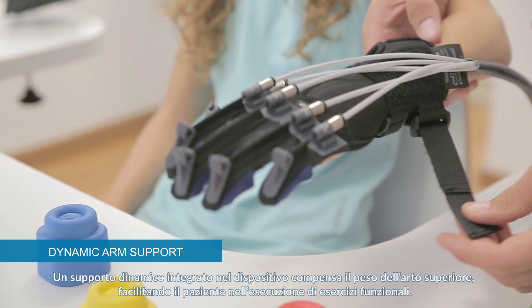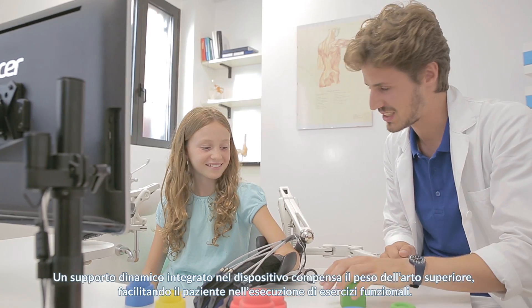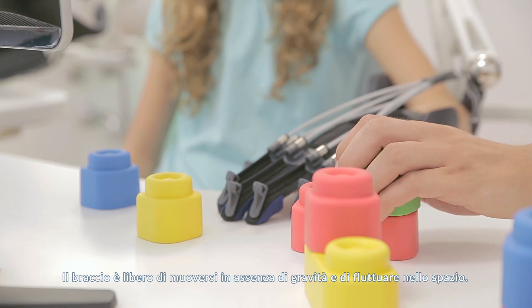An integrated dynamic support relieves the upper limb weight, supporting patients during functional exercises. There is no hindrance for the upper limb, which can be moved freely in the surrounding space.